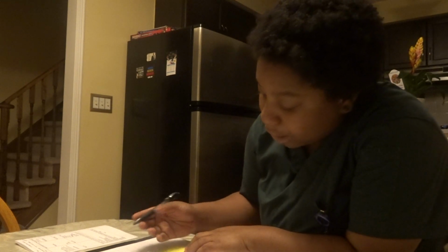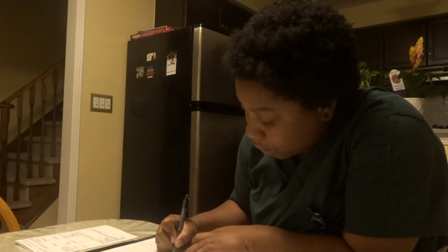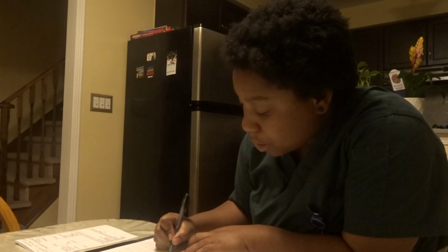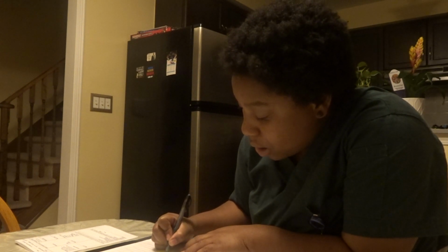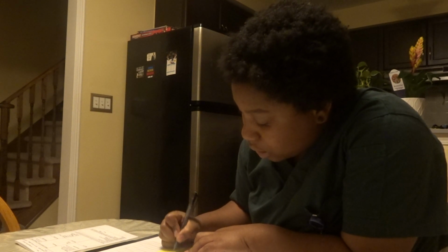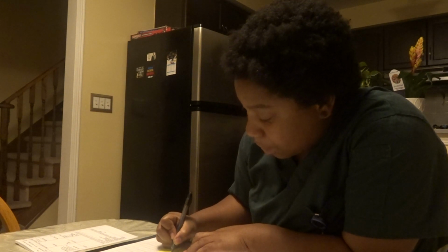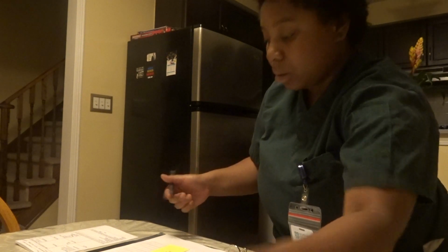So for the drop factor, it's going to be volume over time times the drop. So the volume is 50 milliliters. And the time I'm going to be infusing is 45 minutes times the drop. And the drop is labeled here, which it says 10.